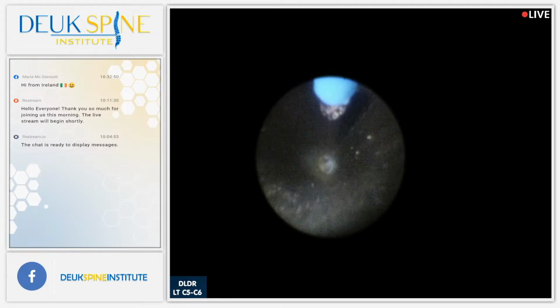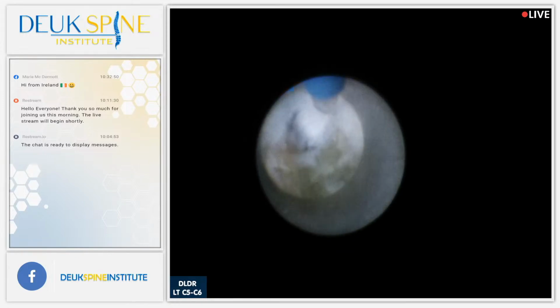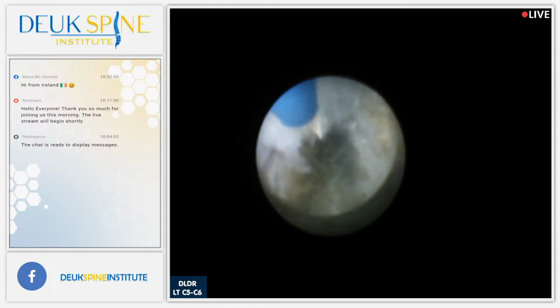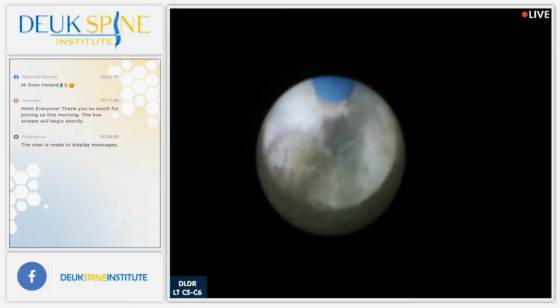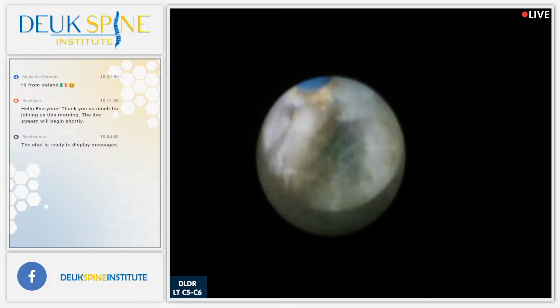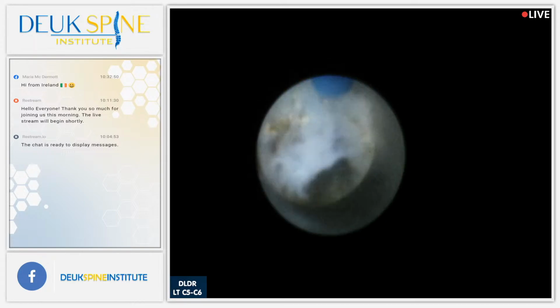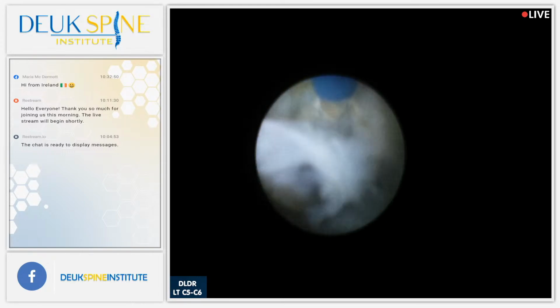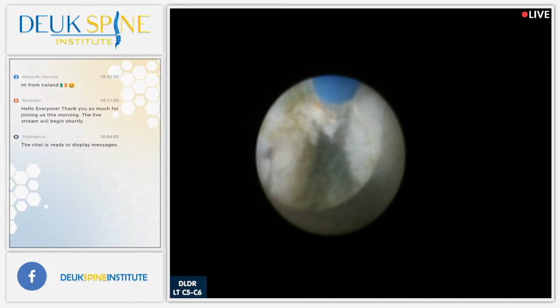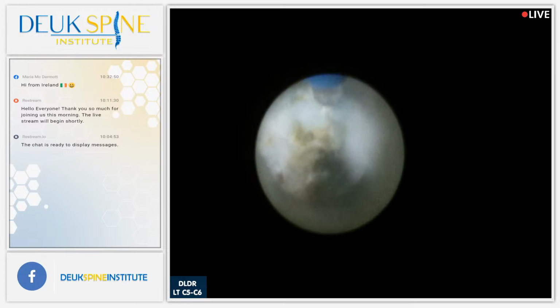Well, let me just see here. You see how the annulus is quite deep. And look at the little calcifications there. That's from chronic inflammation causing dystrophic calcification. Dystrophic calcification is basically your body seeding the tissues with calcium deposits. It shouldn't do that. It only does that to abnormal tissue, damaged tissue. You never see that with normal tissues, only with damaged tissue.